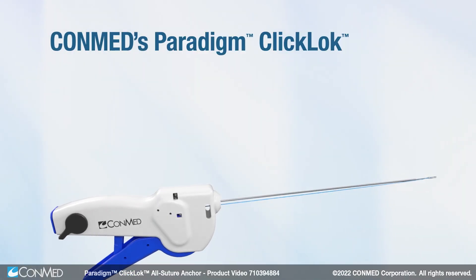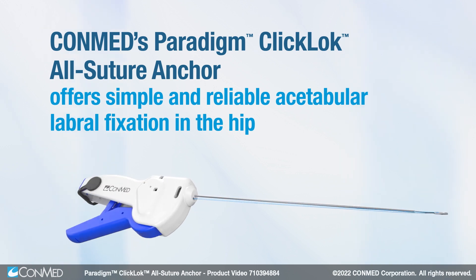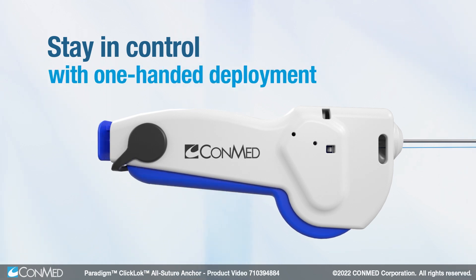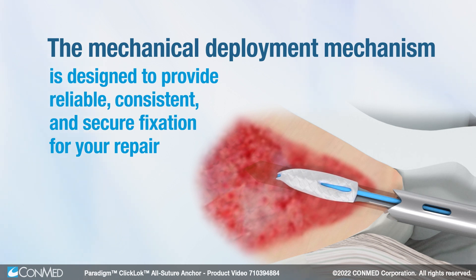Conmed's Paradigm Click-Lock All-Suture Anchor offers simple and reliable acetabular labral fixation in the hip. Stay in control with one-handed deployment. The mechanical deployment mechanism is designed to provide reliable, consistent, and secure fixation for your repair.